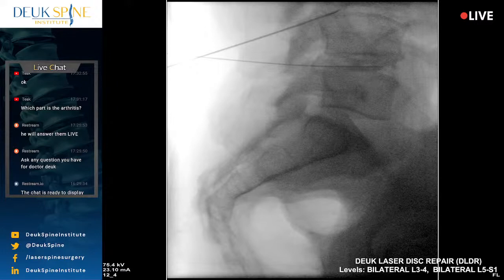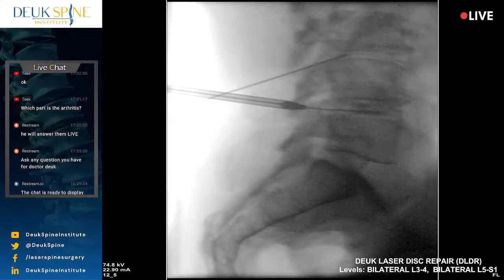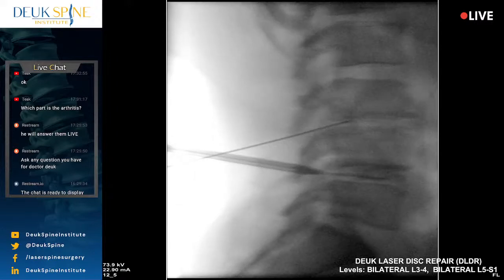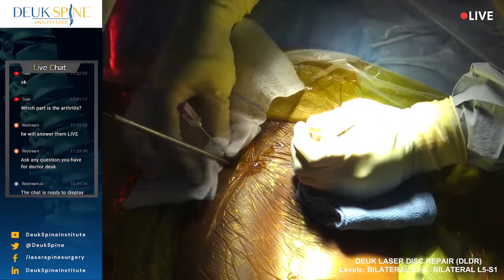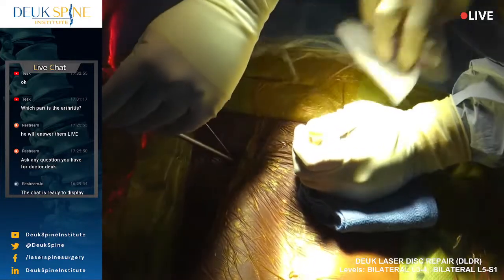You're too south. Shot. So you're too south again. I would just move a slightly bit more north. All right, we're coming in on the L45 shot. You're moving while you're taking the picture. You haven't used the fluoro in a while, have you? No, I'm not moving anything. Yeah, but somehow somebody is.